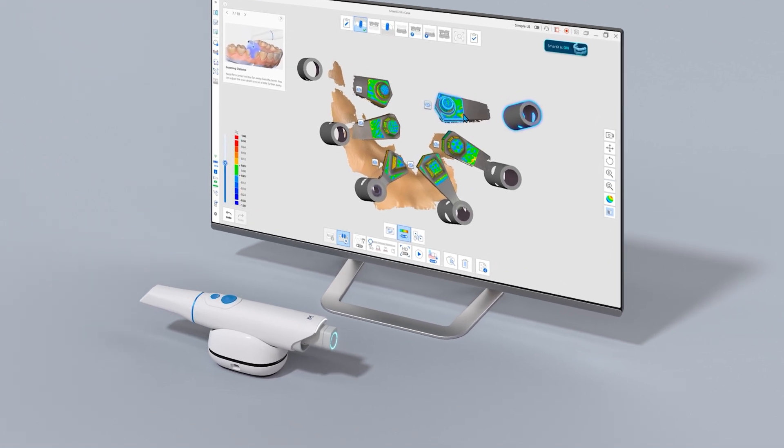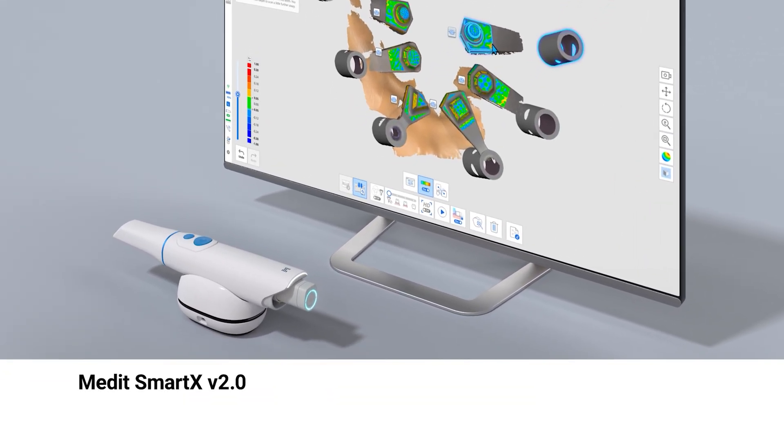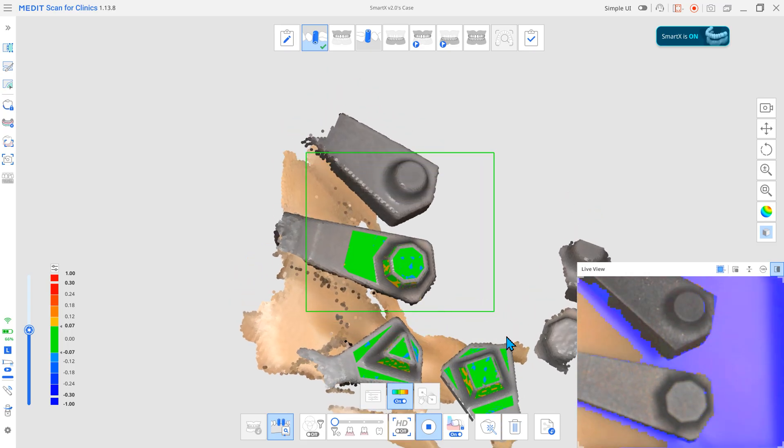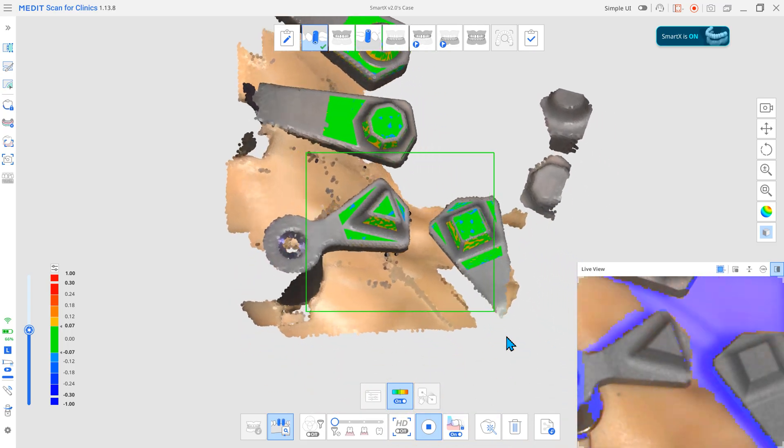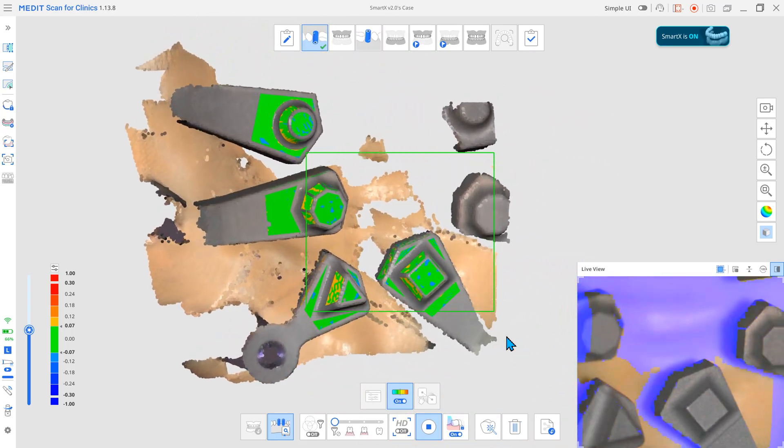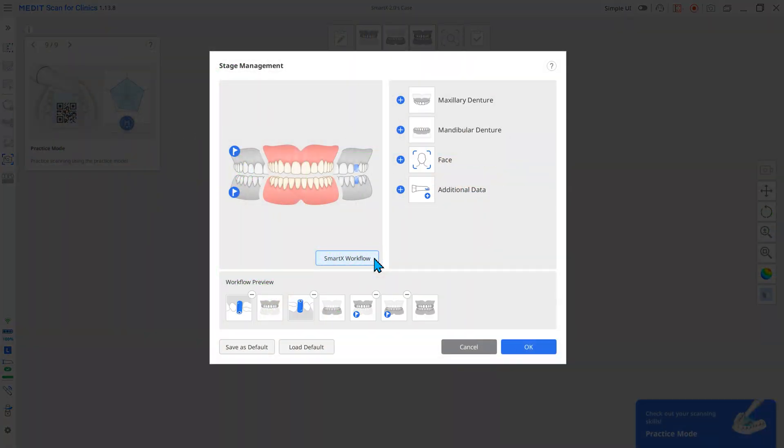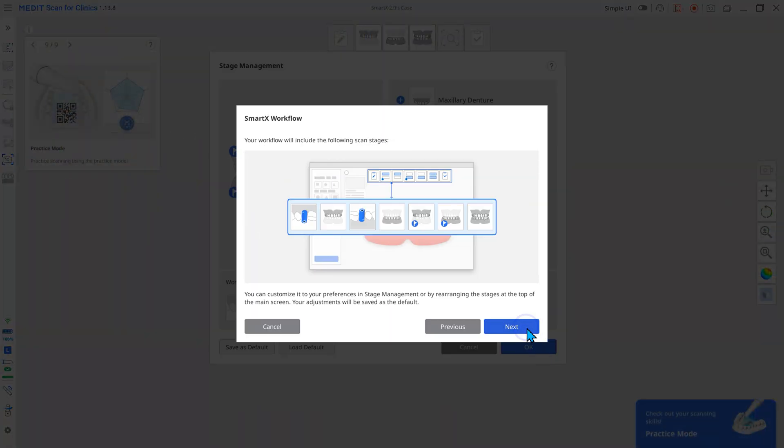The Medit SmartX workflow provides easy and convenient scanning of various types of all-on-X full-arch prosthetics. With this update, we now offer a centralized scan body workflow. Let's explore the new Medit SmartX 2.0 workflow.